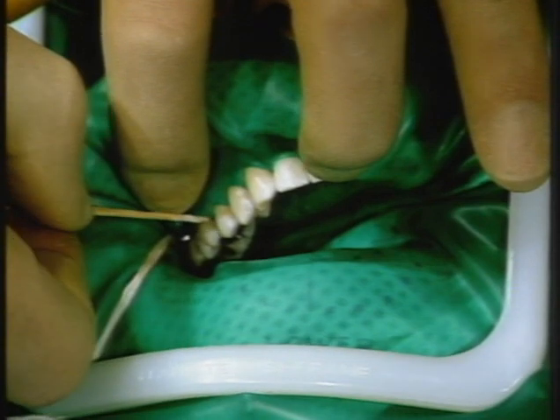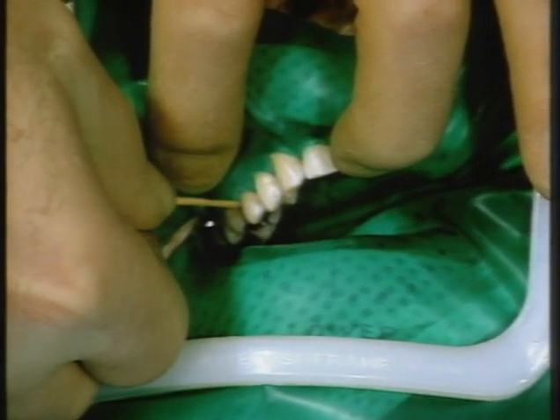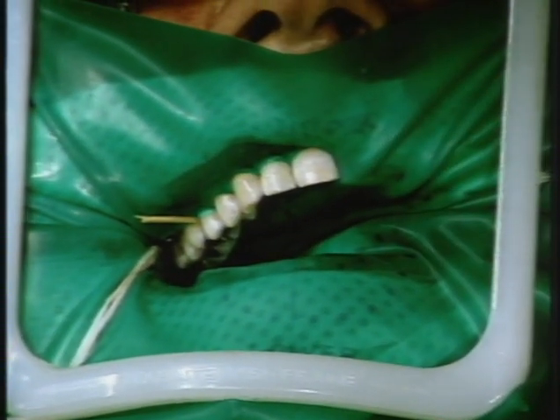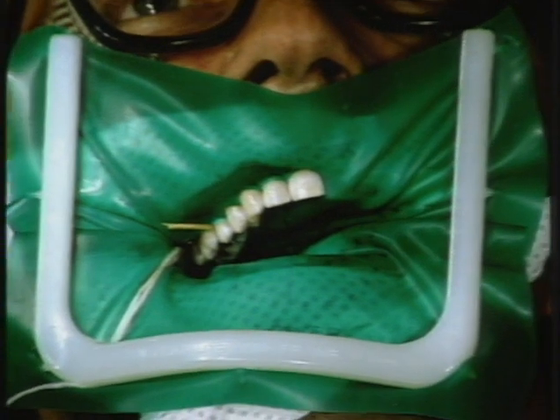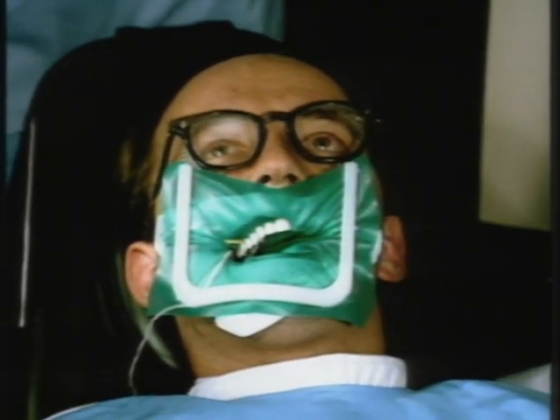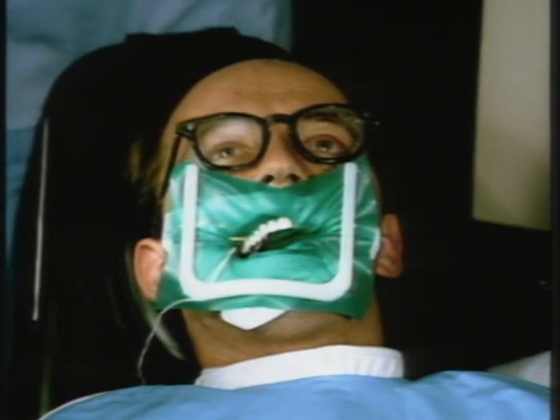Now we just have to put a wedge in between the second premolar and the molar so that we can work at the mesial surface of the molar. A little lubricant always helps, and he's just broken the edge off there. So there we are, we have the rubber dam in position, and we're now ready to proceed with the operative procedure.